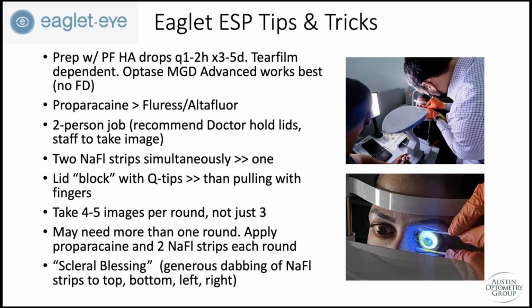It's really not that hard for somebody to point and shoot with the joystick, and honestly your techs handle instruments like that way more often than you do with the other instruments they're using in the office. It's much harder to control the eyelids. And then, as you can see in the photo, what you're really trying to do is block the lid against the orbital bones, and that just works a lot better than using your fingers and pulling up that way.